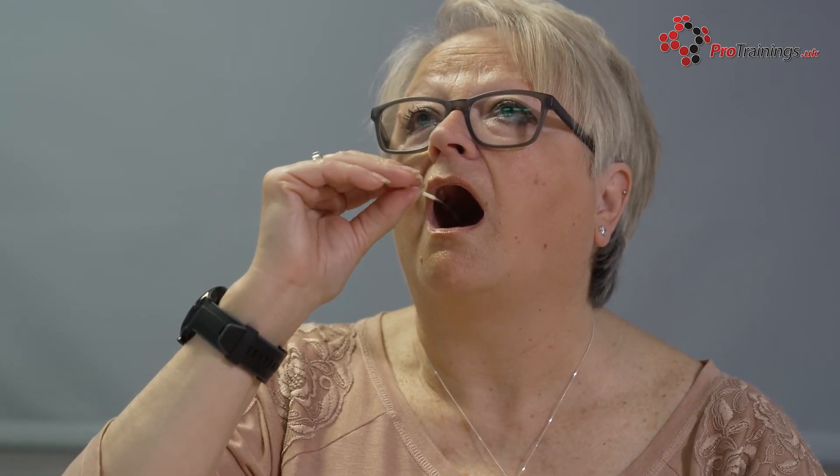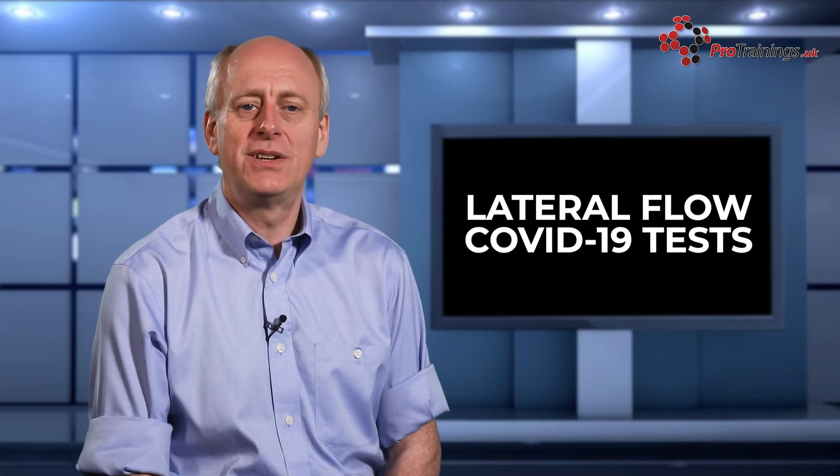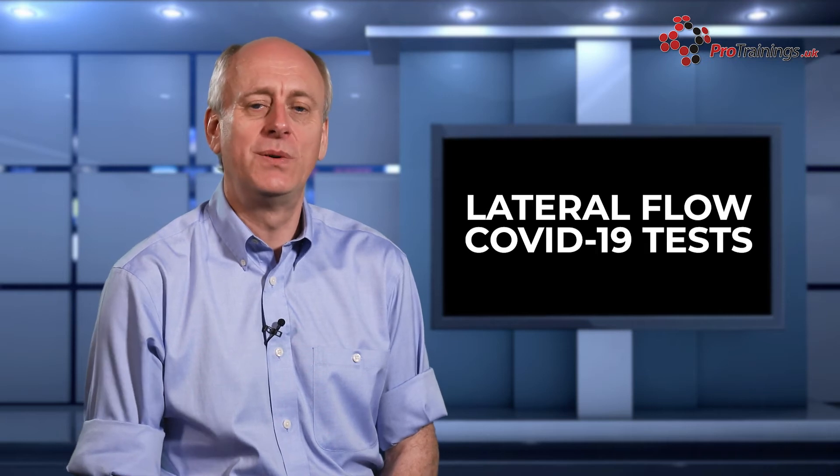Do not touch the soft fabric tip of the swab with your hands. Holding the swab between your fingers, open your mouth wide and rub the fabric tip of the swab over both tonsils, or where they would have been, four times on each side. Do not touch your tongue, teeth, cheeks, or gums with the swab, as this will spoil the sample.